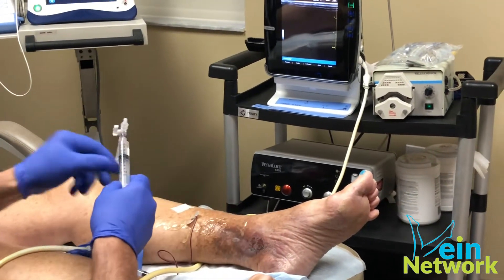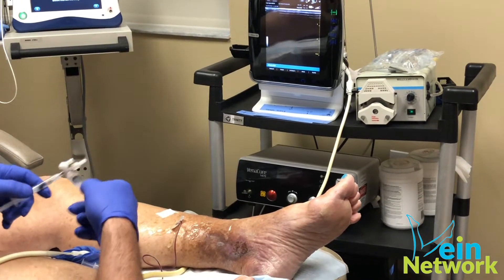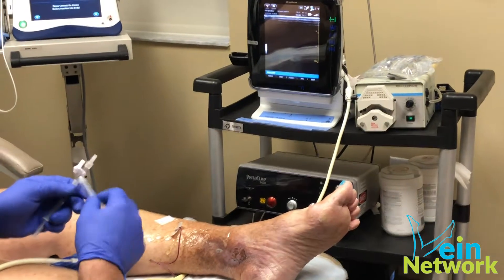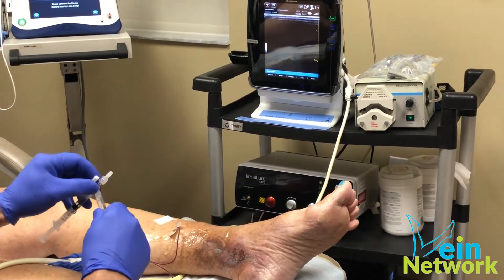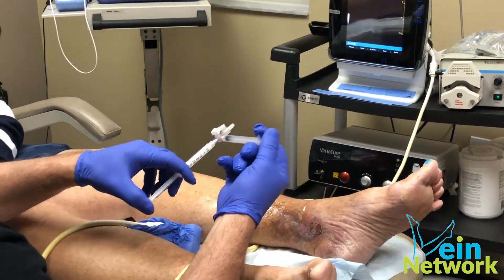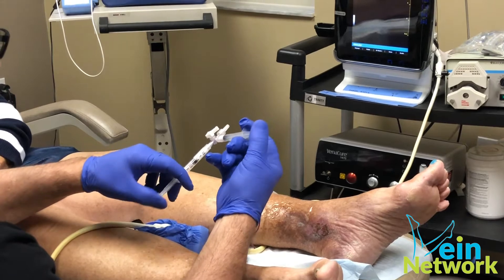This is just kind of residual cleanup — that's exactly how I think of it. I'm making foam now. Watch this: three to one, air to liquid.